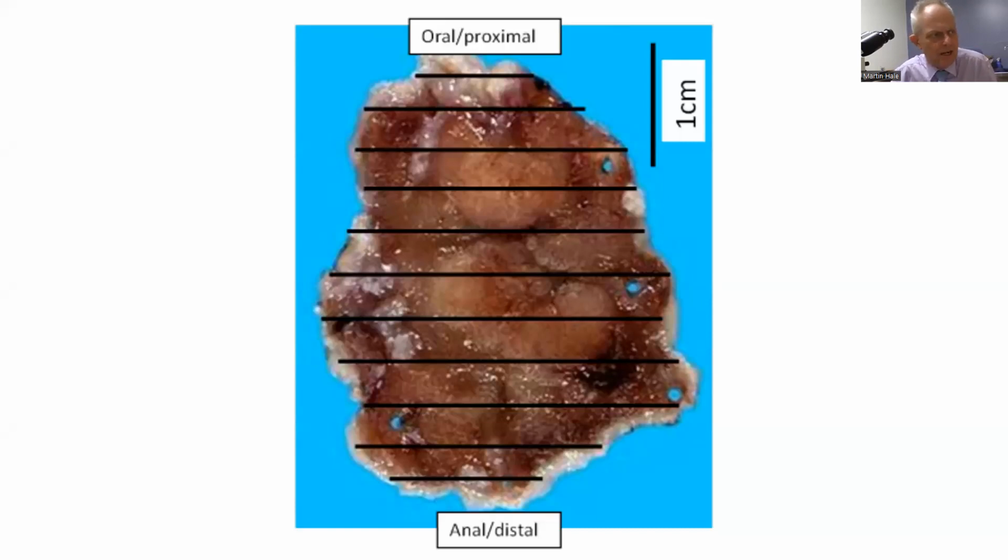I almost visualize myself as going down, as being part of the endoscopy and seeing where it is. And I think that's very important, because then you can actually interact with the endoscopist, and also importantly, you are able to interpret the resection.